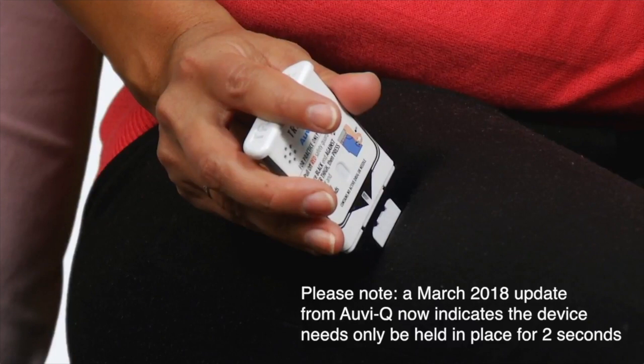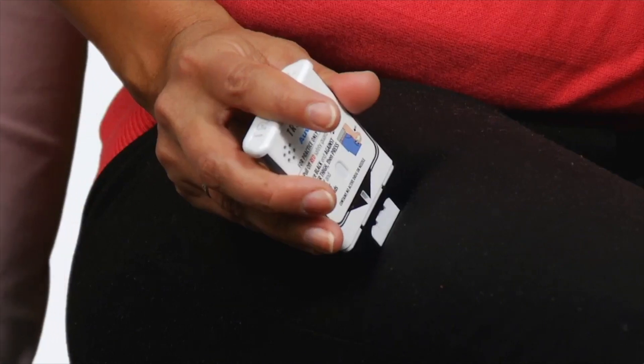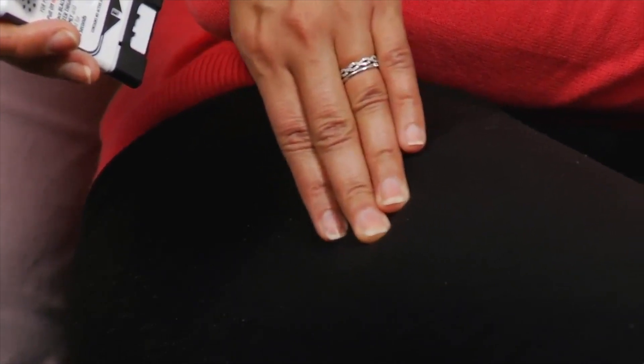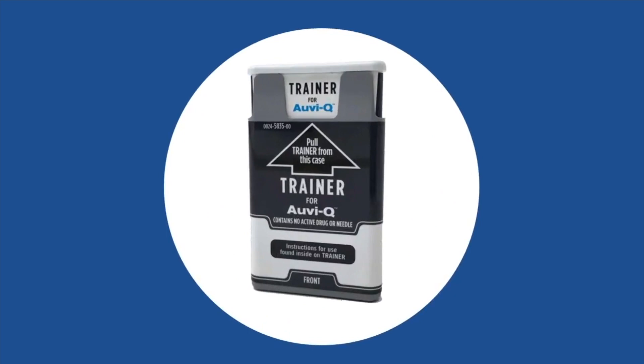You will also hear a 5 second countdown and a voice instruction that will tell you the injection is complete. Auvi-Q will beep and the lights will blink red. Get emergency help right away. A trainer that does not contain a needle or medicine is included with every Auvi-Q 2-pack. It's a good idea to practice regularly with the trainer so you are prepared in the event of an emergency.